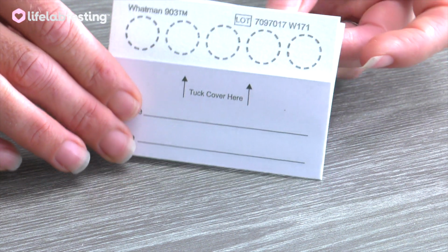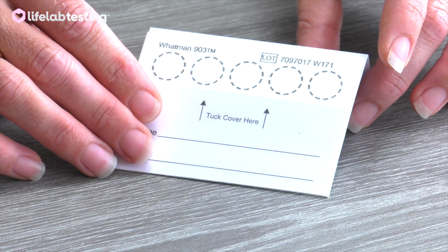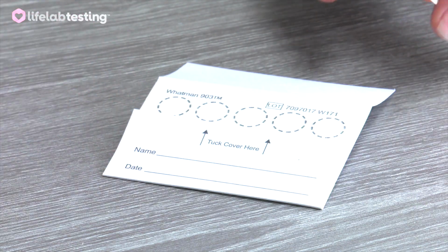Open the blood spot card. Fold the paper back to reveal the collection paper. Do not touch the sample area.